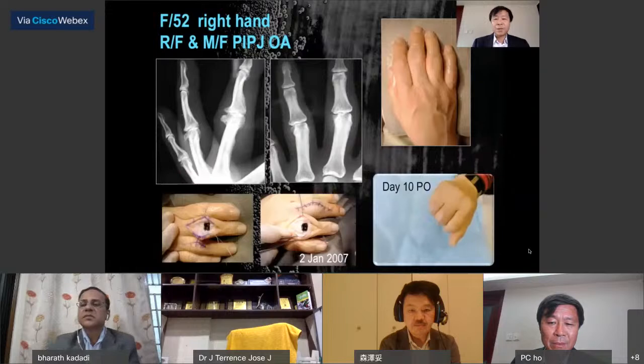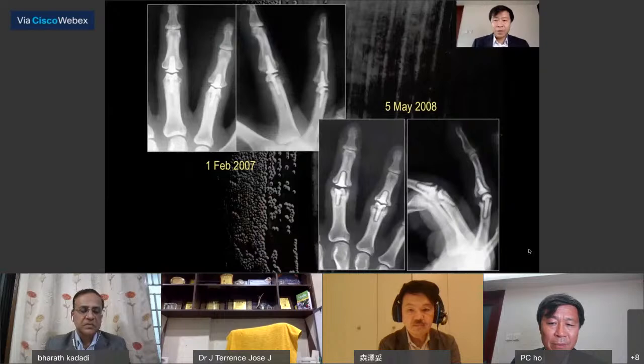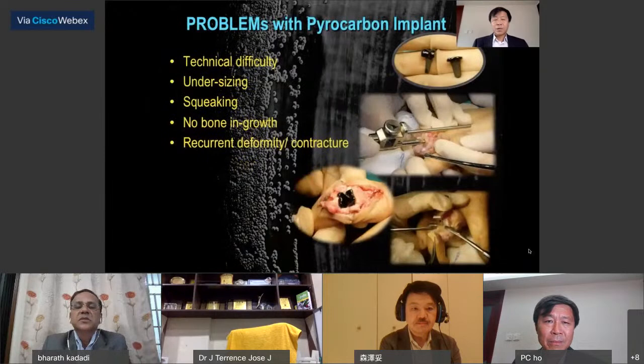Within just over one year, there were already problems with the implant: dislodgement, changing position, and losing the range of motion. That was not uncommon with the pyrocarbon implant, because the technique is quite challenging, with meticulous bone cutting work, and the surgeon will tend to use a smaller size implant because of worry about overcutting the bone. Squeaking is always a nuisance and there is no bone ingrowth for the implant. Therefore, recurrent deformity and contracture is not uncommon.